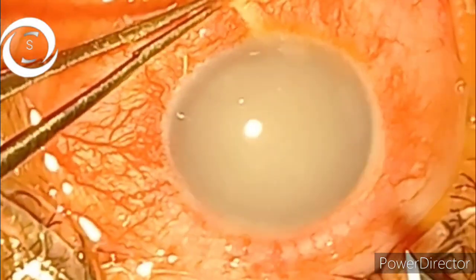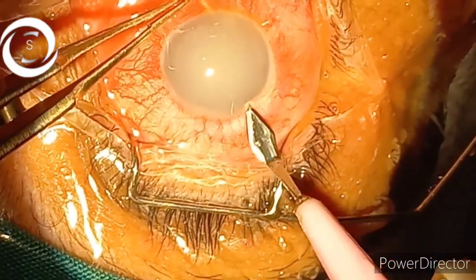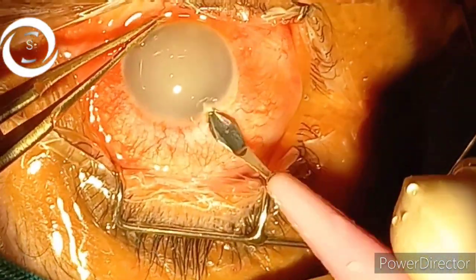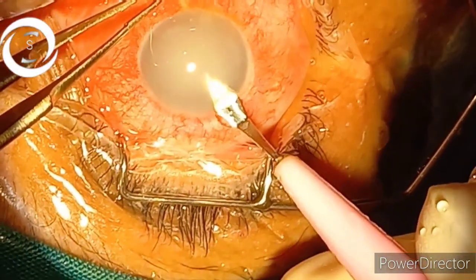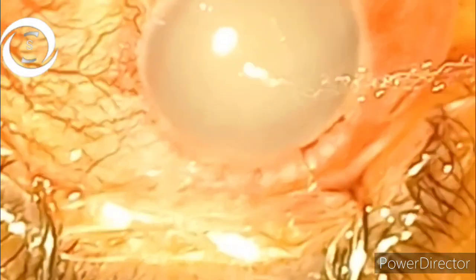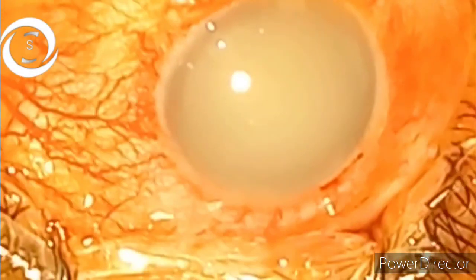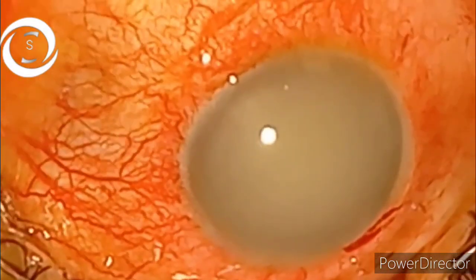I have a complete video of the surgery. Here I am just showing you glimpses of the surgery, that when you enter into the anterior chamber and perform irrigation aspiration, all the anterior lens matter which has escaped the capsule can be removed.